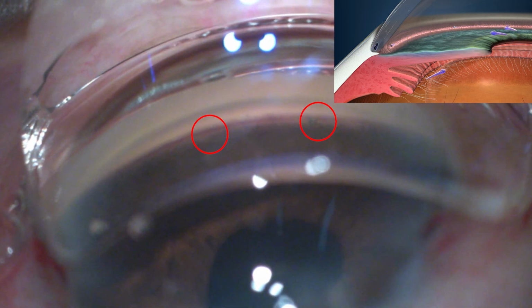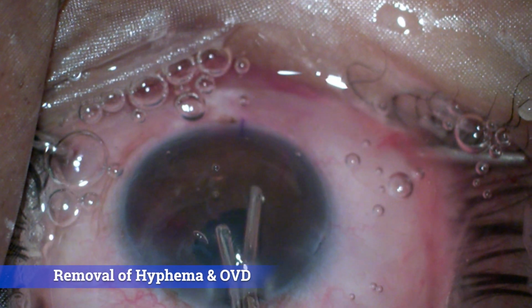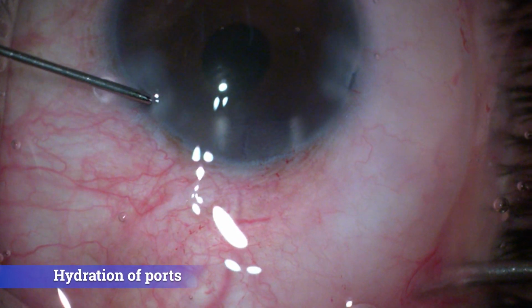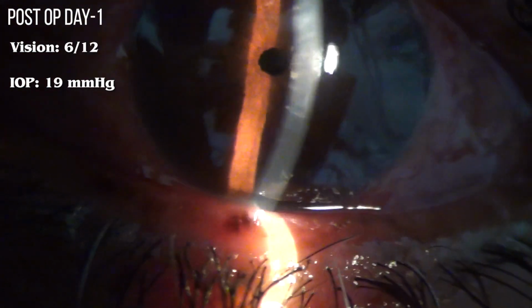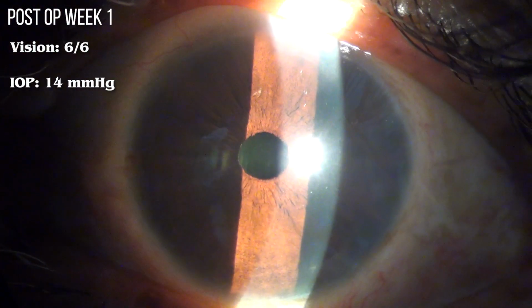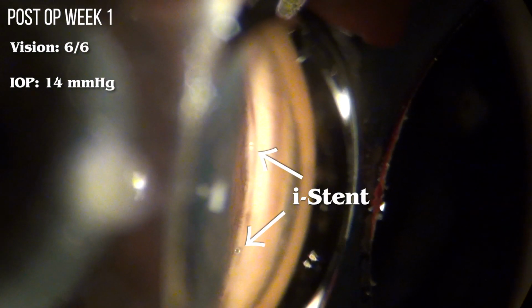It is very common to encounter bleeding while implanting the eye stent, which can be washed using irrigation and aspiration while removing viscoelastic, and wounds are hydrated to close the eye. On first post-operative day, one may note a small bleed around the stent area. On first post-op week, patient had 6/6 vision and an IOP of 14 mm of mercury. And this is the angle of the patient demonstrating eye stents in place on gonioscopy.